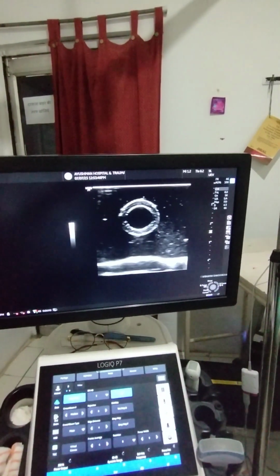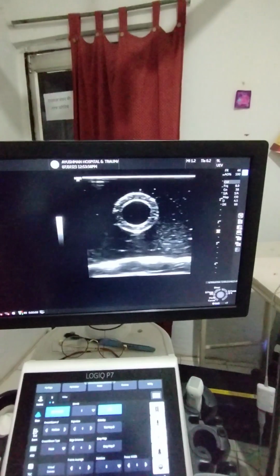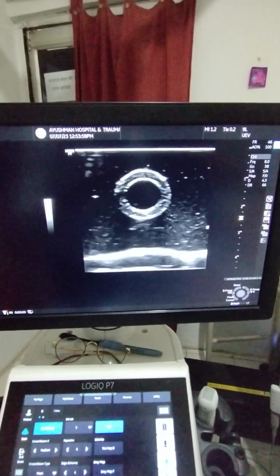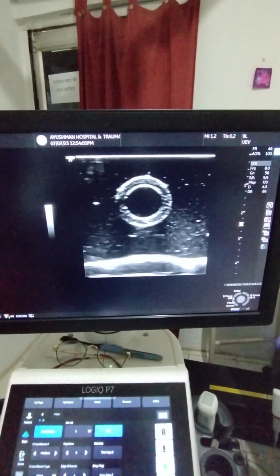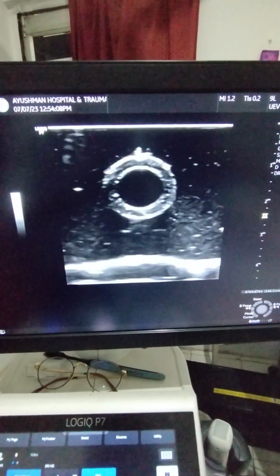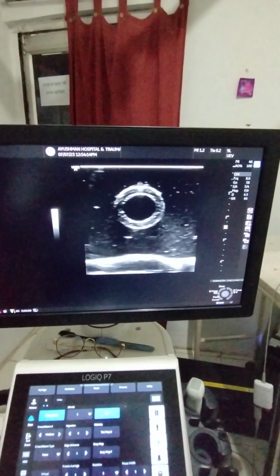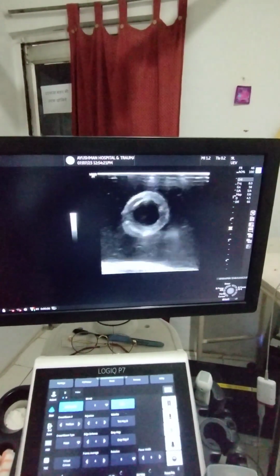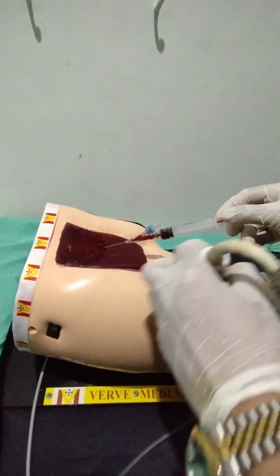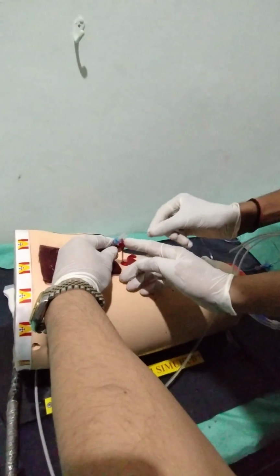So you need deliberate practice, those who are novices, on how to stabilize the probe, maintain the angle and puncture. It's not in the center, but this is our needle. I'm tethering to the wall, and now I'm going inside. So here comes the blood. Show the blood. So we are in the artery, but let me see if it is pulsatile. So this is pulsatile.